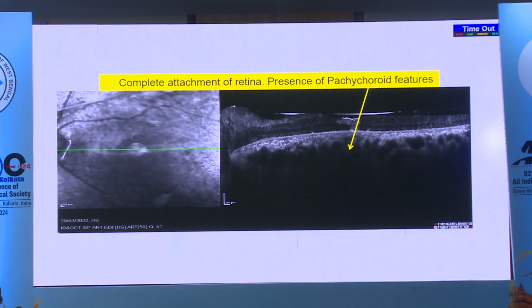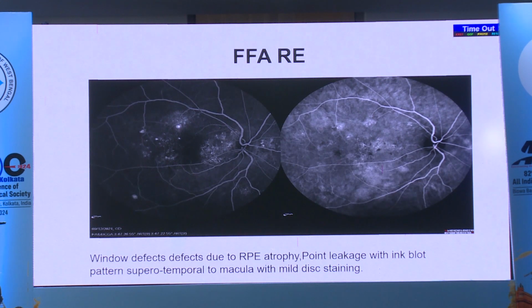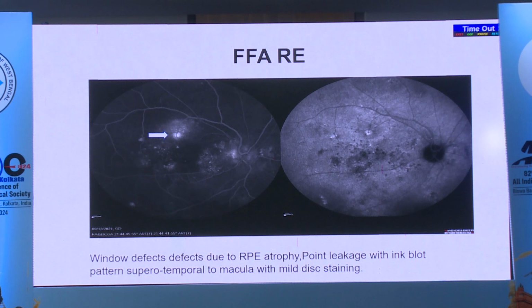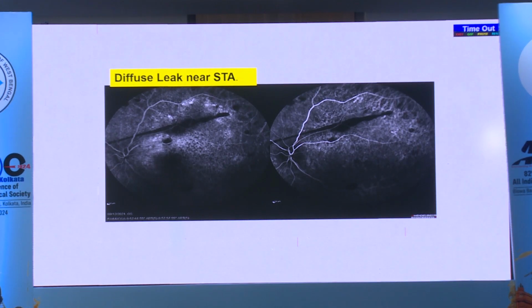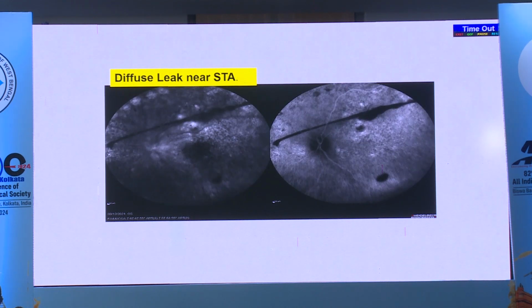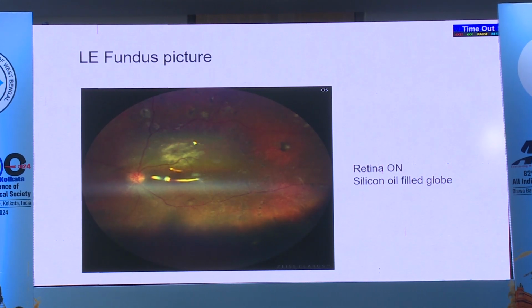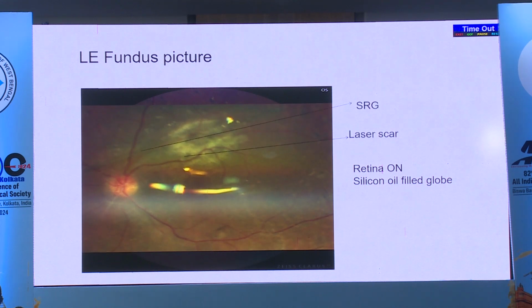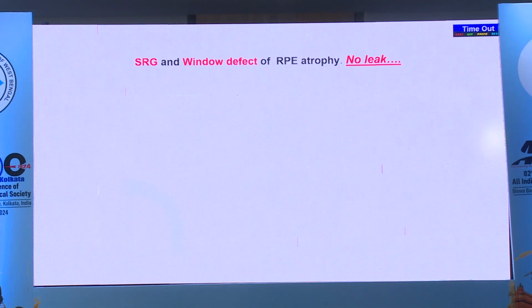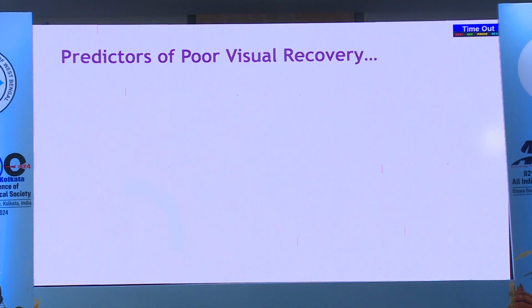Fluorescein angiography shows a diffuse RPE epitheliopathy and choroidal vascular hyperpermeability, giving the diagnosis of chronic CSR in one eye, and you have a bullous exudative RD in the other eye. So with this patient under oil, the angio shows this extrafoveal diffuse leak, for which a grid kind of laser was done, and then the patient goes into remission with an attached retina, and silicone oil removal is done. So we have to tackle such cases with bullous RD sometimes surgically, as a rare entity, but still an extreme case to be treated in the CSC spectrum.